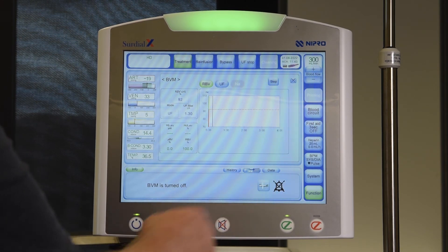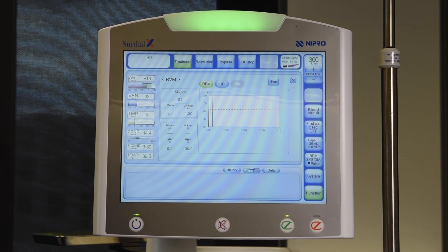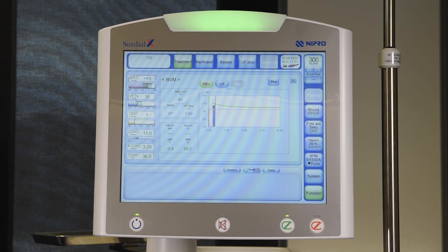After a control mode change during therapy, the feature is restarted and the previous history will no longer be shown.